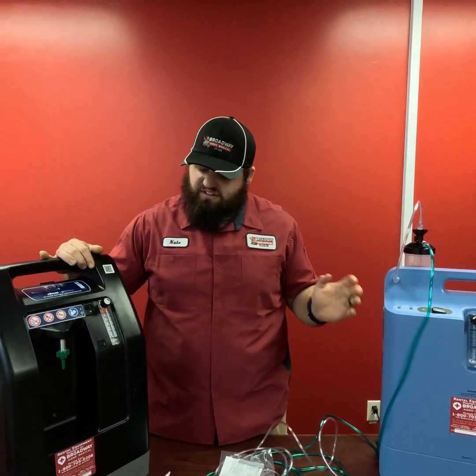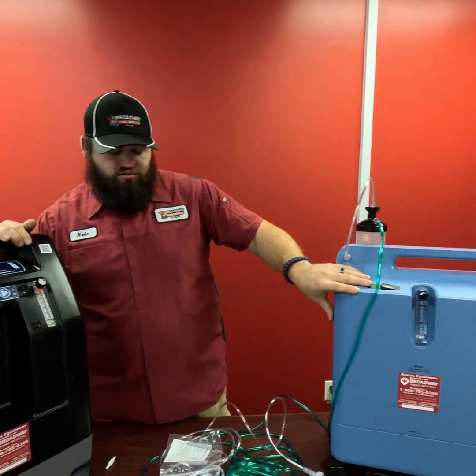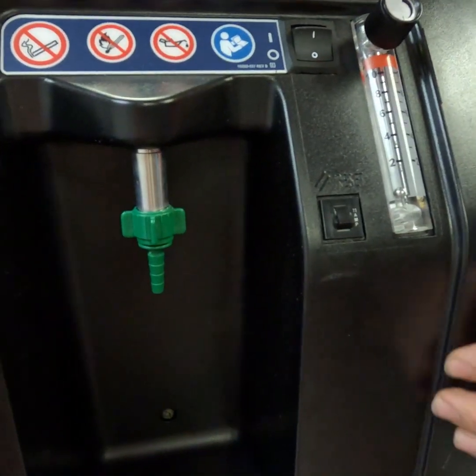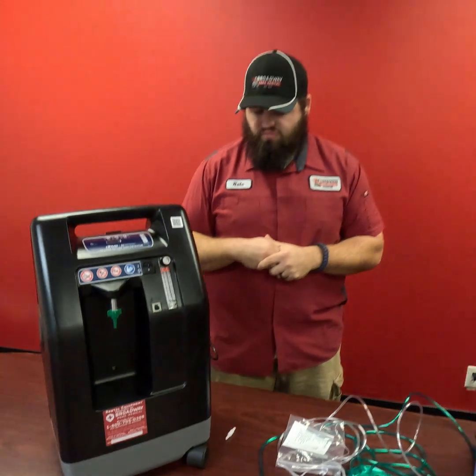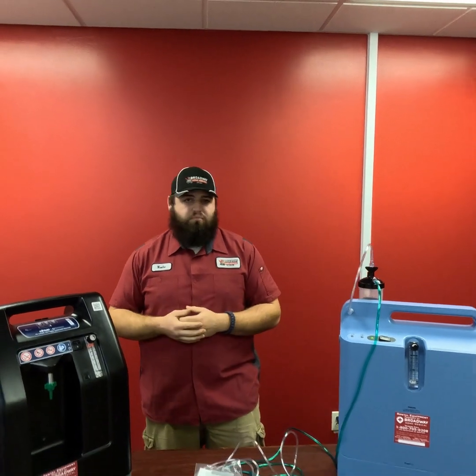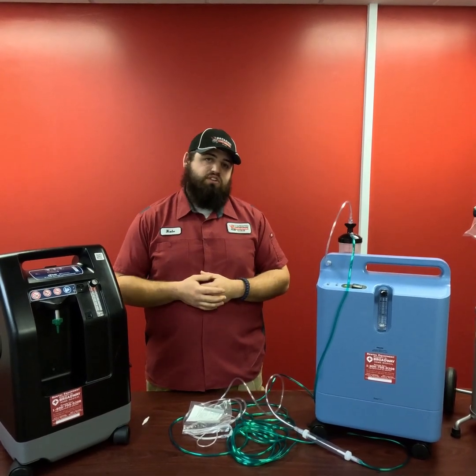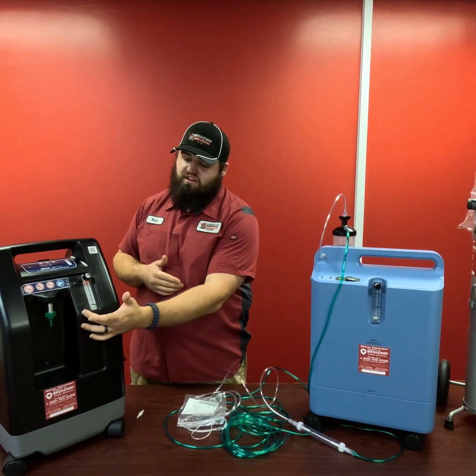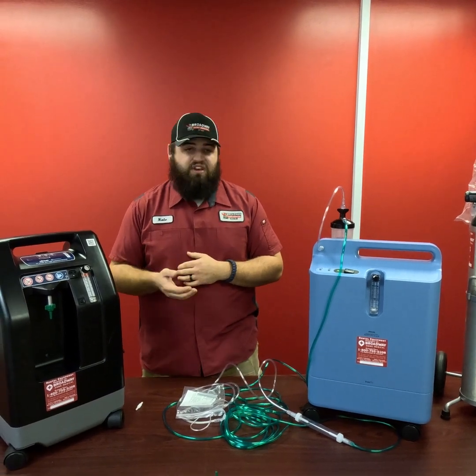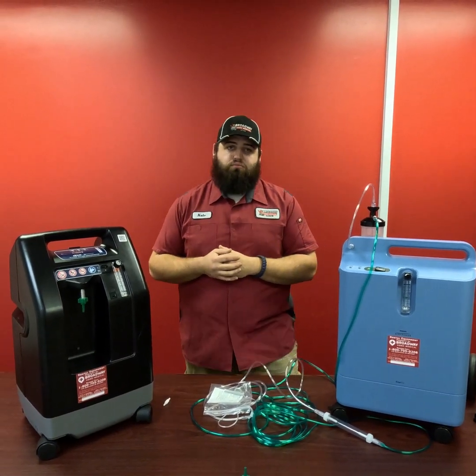Now, back to the front on this machine. On this EverFlo, it doesn't have a breaker switch on it, but some of the machines do. This machine here does have a little switch here, and that's just in case the electricity was to surge or anything like that, and it's popped the breaker. It's just to help protect these machines. If you do have a power surge and your concentrator isn't working afterwards, I recommend you take a look at that switch to see if it has been tripped. If it has, go ahead and switch it, then shut your machine off and turn it back on and see if that resolves anything.